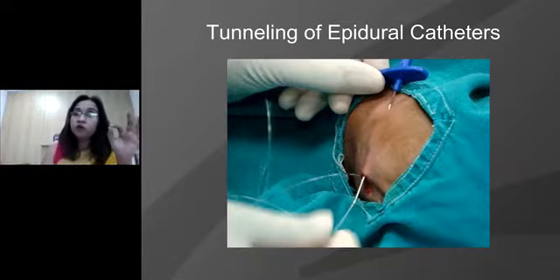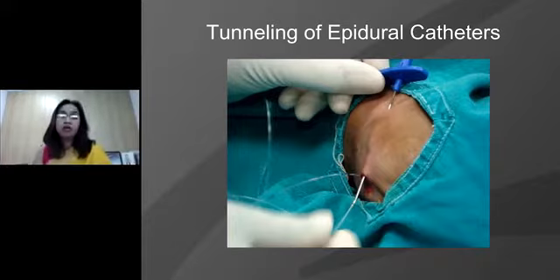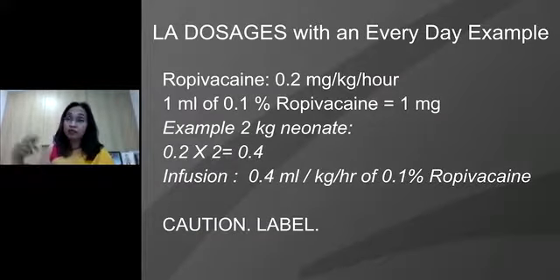Secondly, we are going to often get calls from the PICU or an ICU that the catheters are leaking. Usually there is a back leak because the pressure gets built up in the epidural space, and so it just gets back leaked. The back leaks are accepted. Whatever needs to go inside does go inside. So continue with your infusions, let the back leak happen, put a pressure dressing, but tell everybody what is expected so that they do not get really worried about it and pull out your catheters thinking that the catheters are not working well.